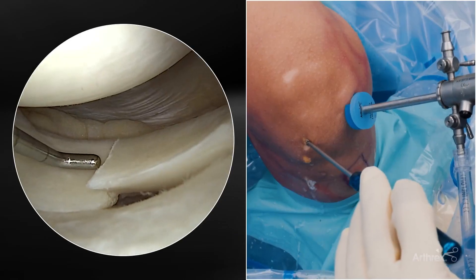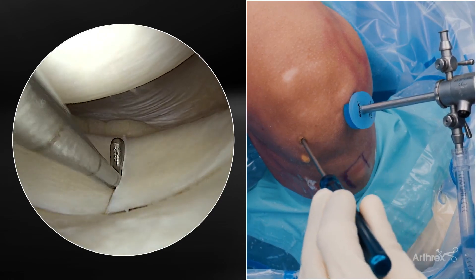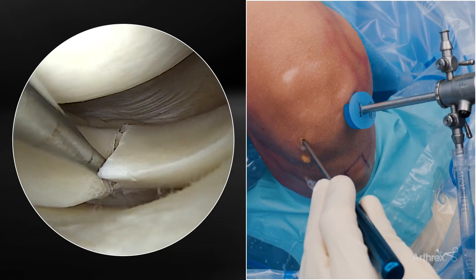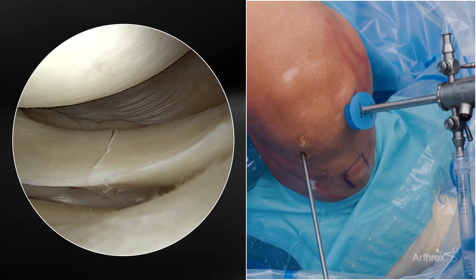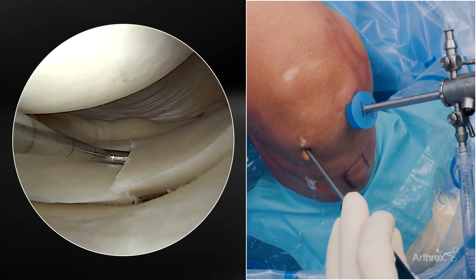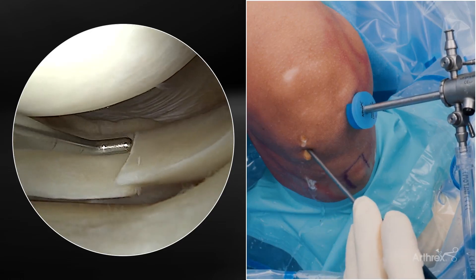Here I'm coming through my initial lateral portal, which I like to make a little bit higher. But when I do a lateral meniscal repair, because I like to come with my implants to the posterior horn from the ipsilateral side, I almost always create a more inferior portal. You can see this line of trajectory towards the meniscus is much more direct and allows us to get around the condyle without scuffing it.